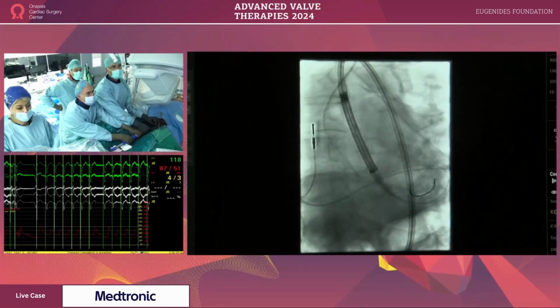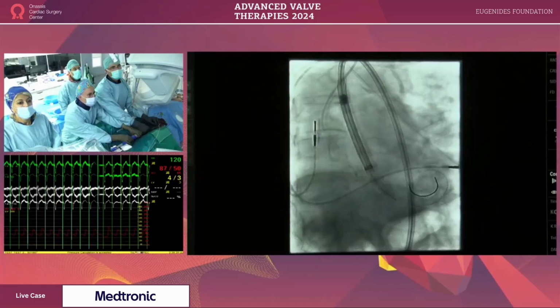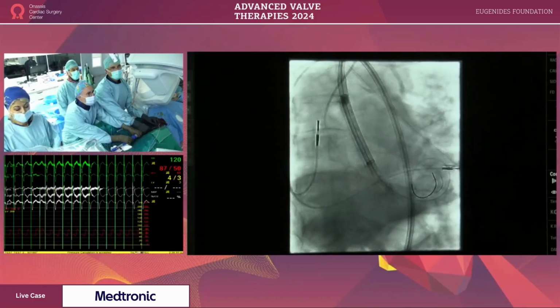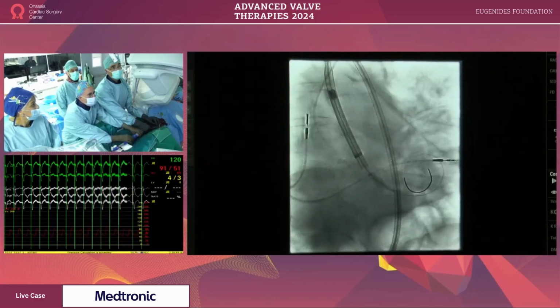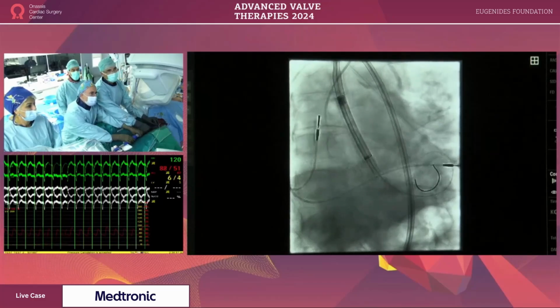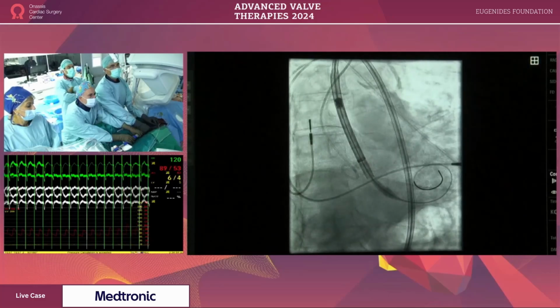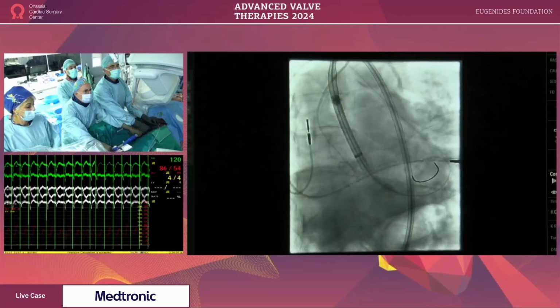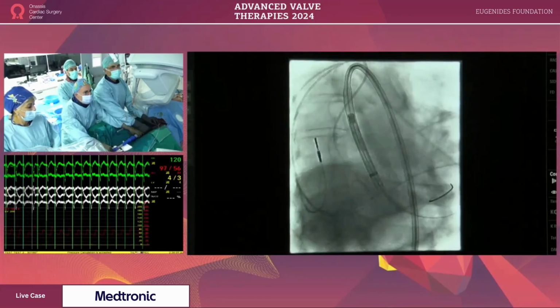And I think that one of the most important things that an operator should remember is not to panic when the patient is going down with his blood pressures. It's not catastrophic that the patient will be 30 seconds with low blood pressure and you move the eye right and left and see the perfect position. So you're absolutely right. I think it's very important, as you said, when you're on the cusp overlap or near cusp overlap, to make sure there's no parallax of the valve. Of course.